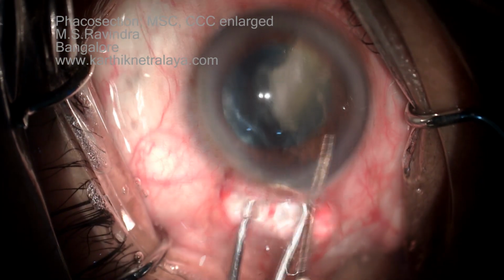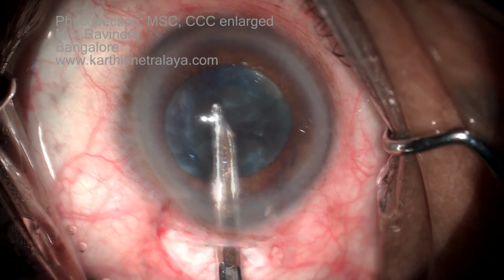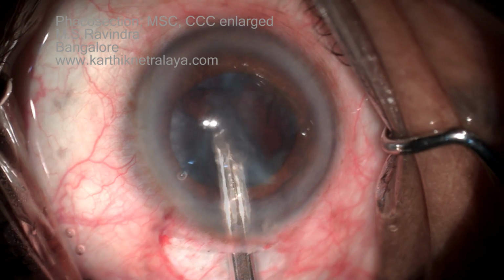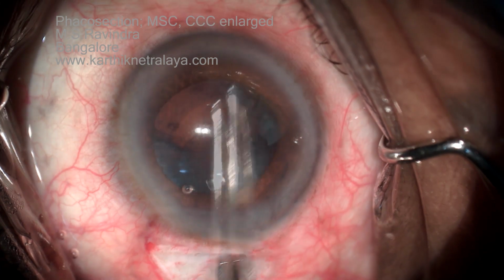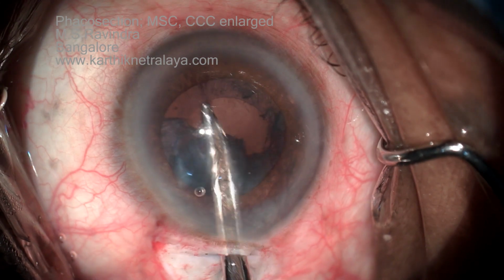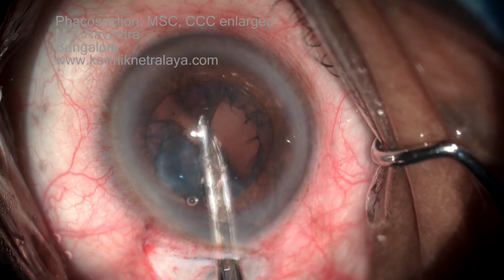So the viscoelastic is continuously injected into the anterior chamber in addition to scoring the nucleus, which minimizes the endothelial touch of the nucleus. The heminuclear pieces are easily viscoexpressed from the anterior chamber. Complete cortical aspiration is essential in such a case because small wisps of cortex will be stuck onto the equator, and need to be removed to minimize postoperative inflammation.